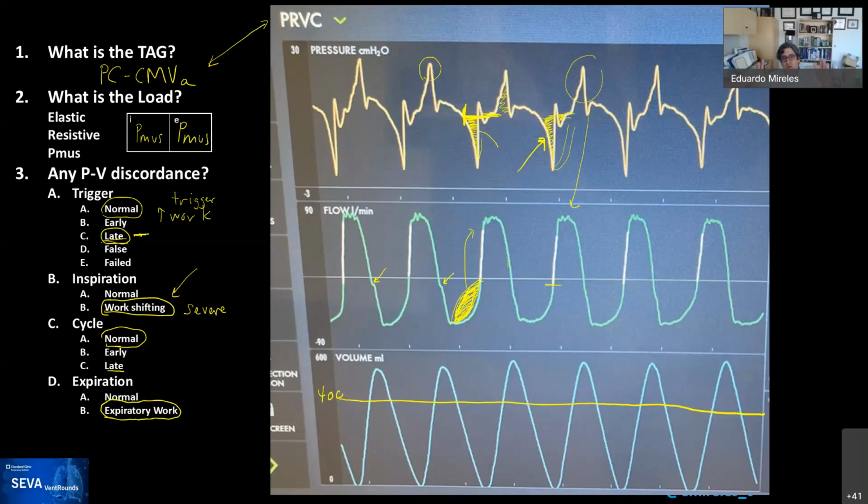when I think about how to approach mechanical ventilation, it's always useful to see the patient and think of them under the three goals of mechanical ventilation, which would be safety, comfort, or liberation. The reason why I like to do that is because I choose the one that is the primary. It doesn't mean that I abandon safety or liberation, but it helps me understand how I'm going to act on it. So I presume that Aman chose pressure support thinking about comfort, and I would ask Aman to talk a little bit about why he chose that.